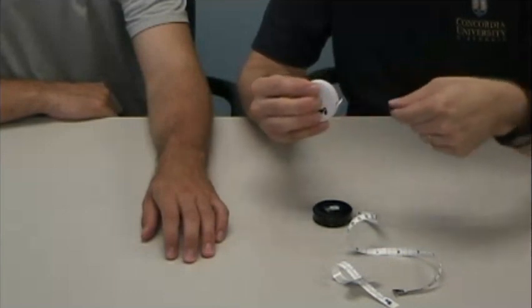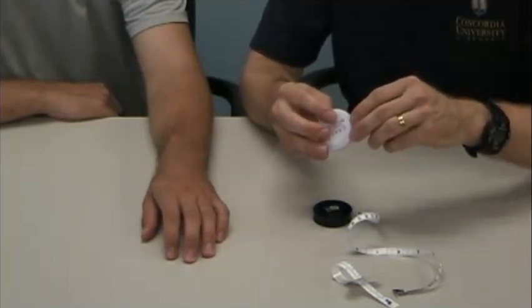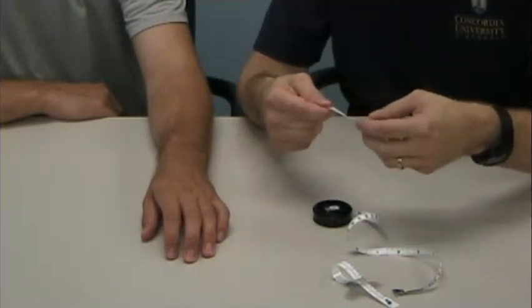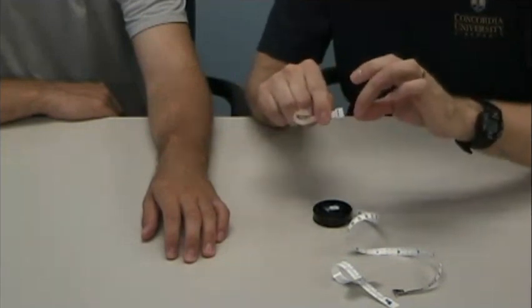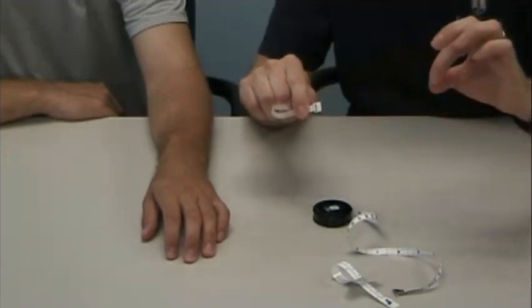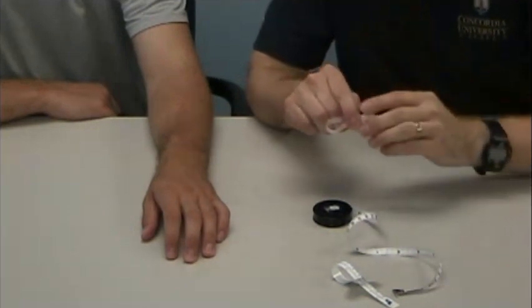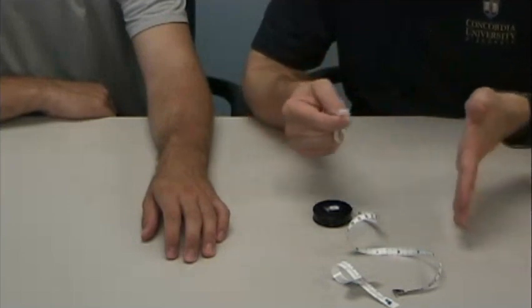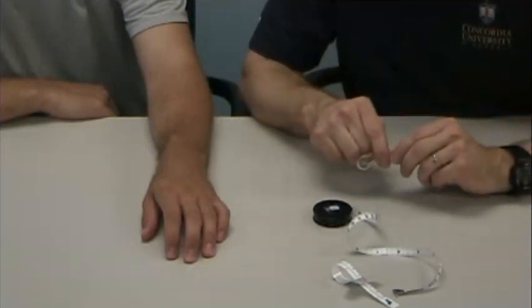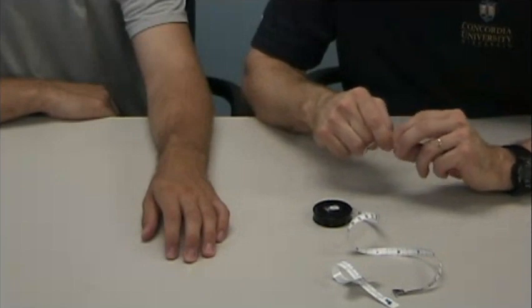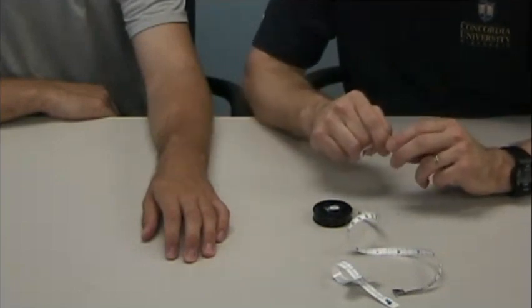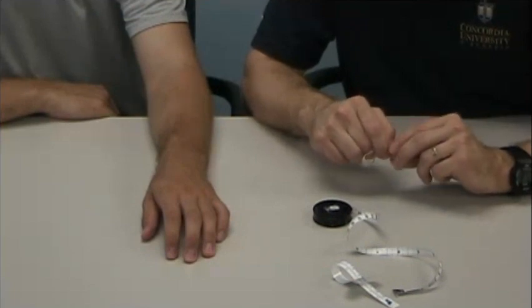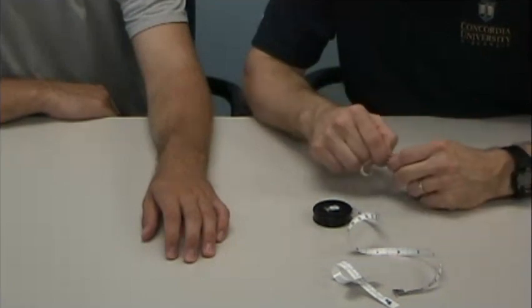There is a tape measure called a Gulick Anthropometer that has a device on the end with a little spring. You pull on that spring-loaded device until it shows a line that's contained in there, and that way you get the same amount of tension every time you measure. That will bring some reliability to these circumferential measurements. But even then, it's not the best or most reliable measurement for edema. However, it is fairly quick and easy to do.